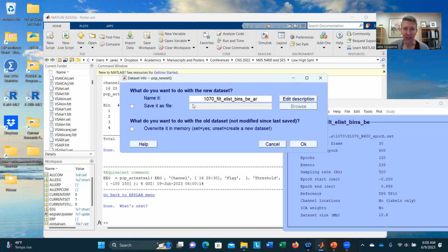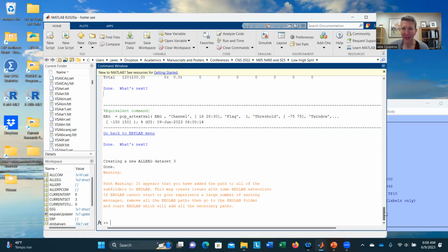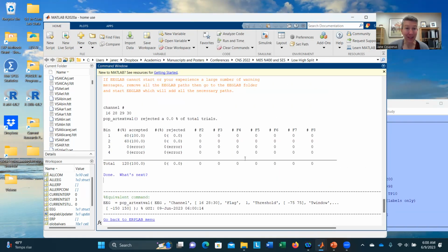Oh, actually, I'm not going to save that. But generally, you could save this to the desktop, but you don't have to. And I'm going to go ahead and click OK. And as I was starting to say, in the background, your MATLAB is doing things.